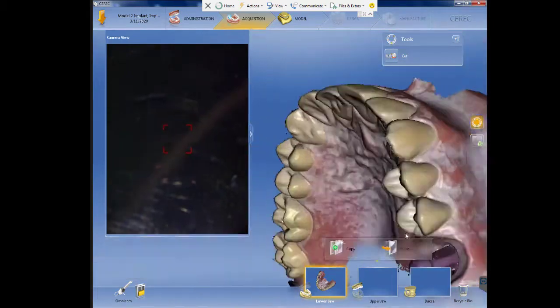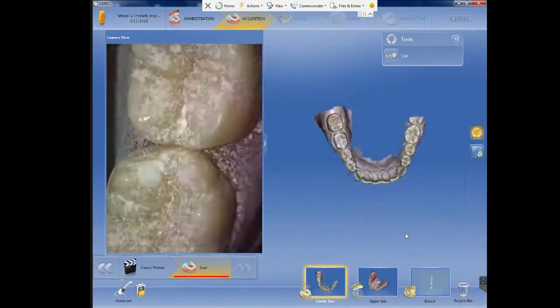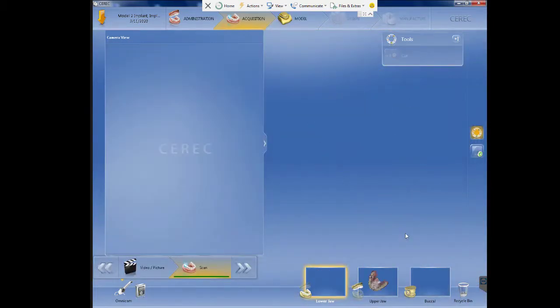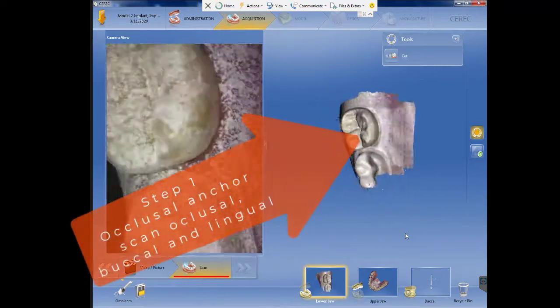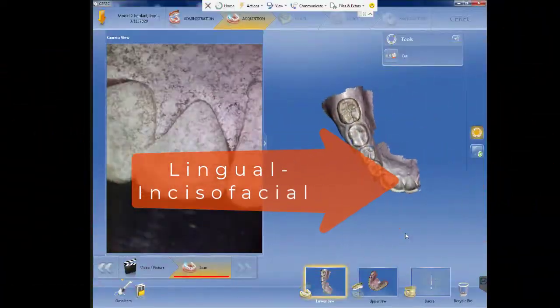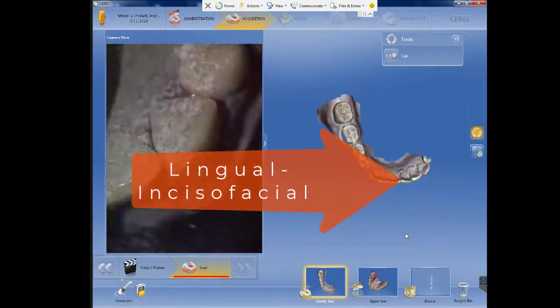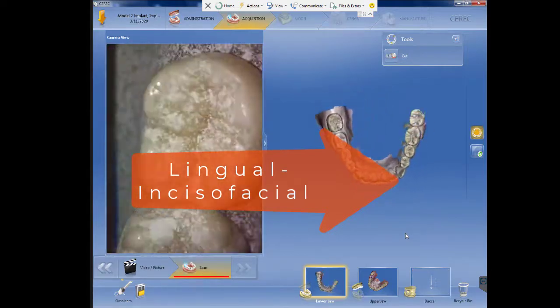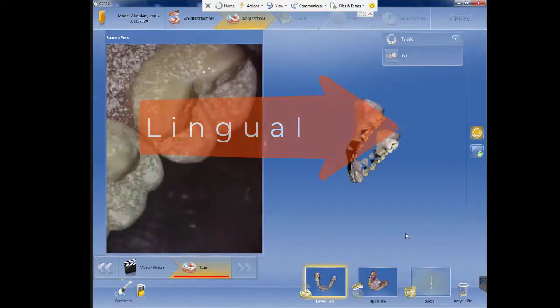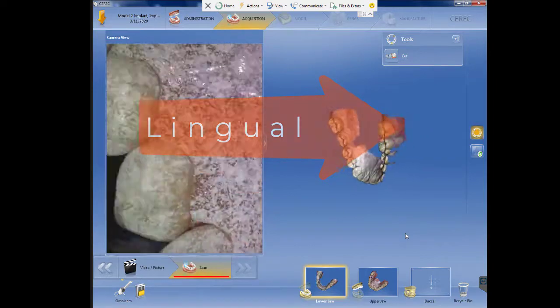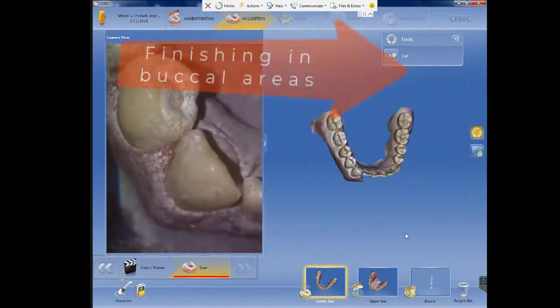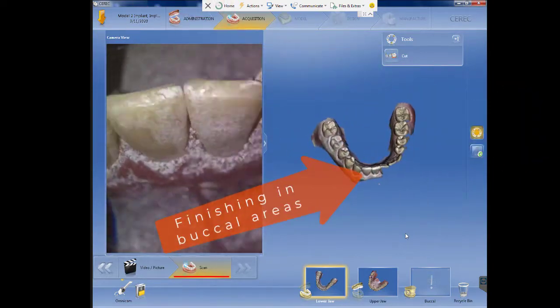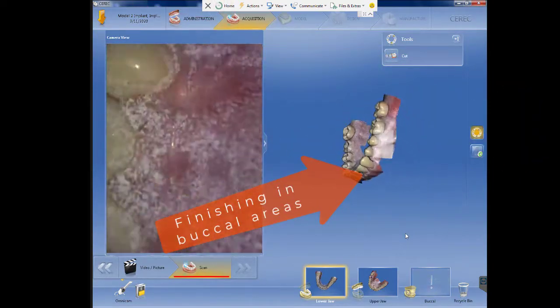We'll first start scanning the occlusal surfaces, giving an anchor from buccal to lingual, then passing through the lingual or palatal and incisal surfaces. Then you will go through lingual surfaces and then you will go through all of the buccal surfaces.